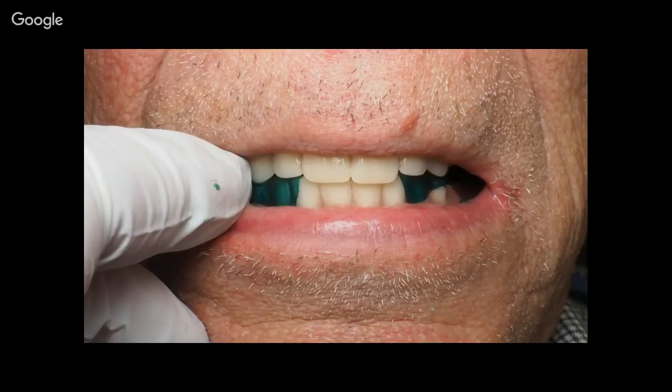And unlike in natural dentition, where everything's fixed together and it stops right there, these are just soft tissue borne bases. So the bases just shift a little bit and the teeth still come together, but it's not really the true bite. And so you end up with spots all over the denture from your articulating paper, and you just go arbitrarily and start adjusting on them.